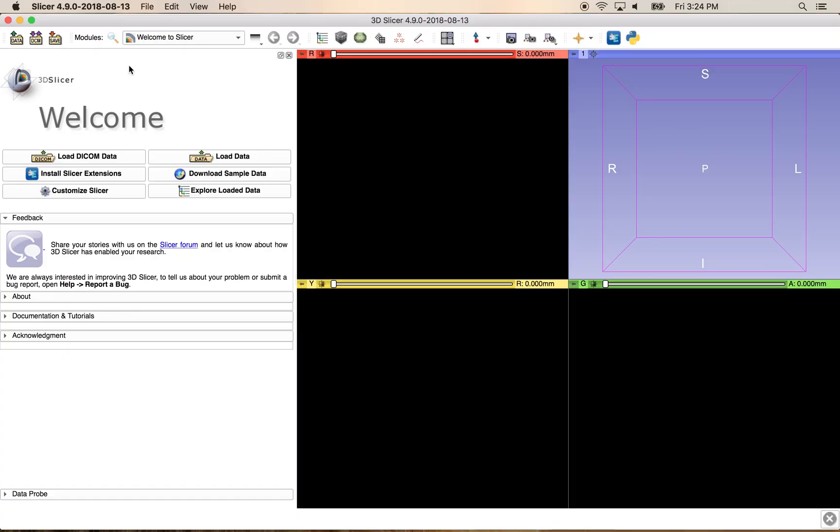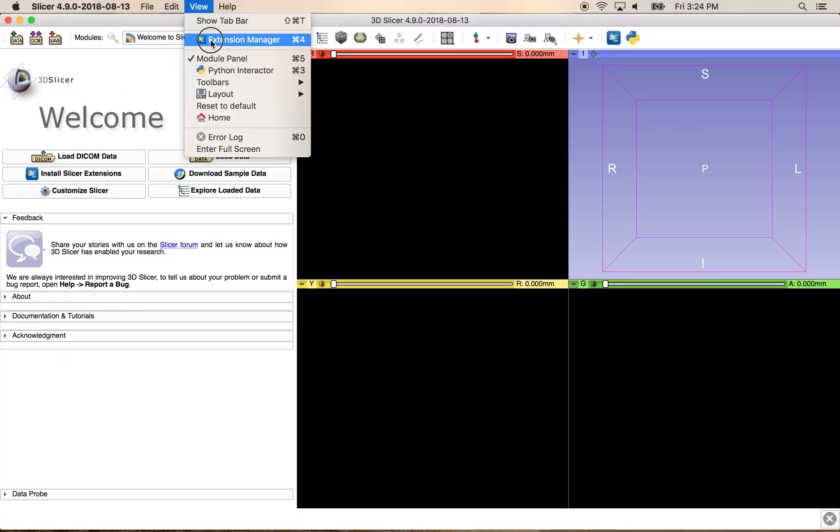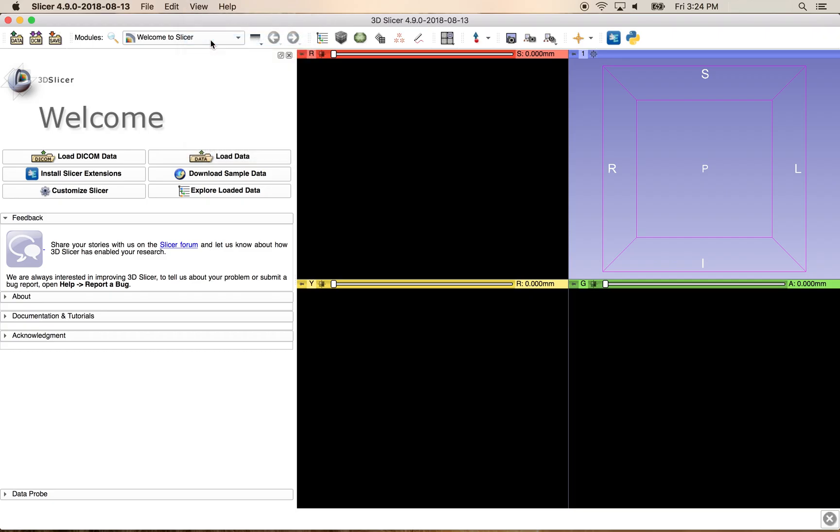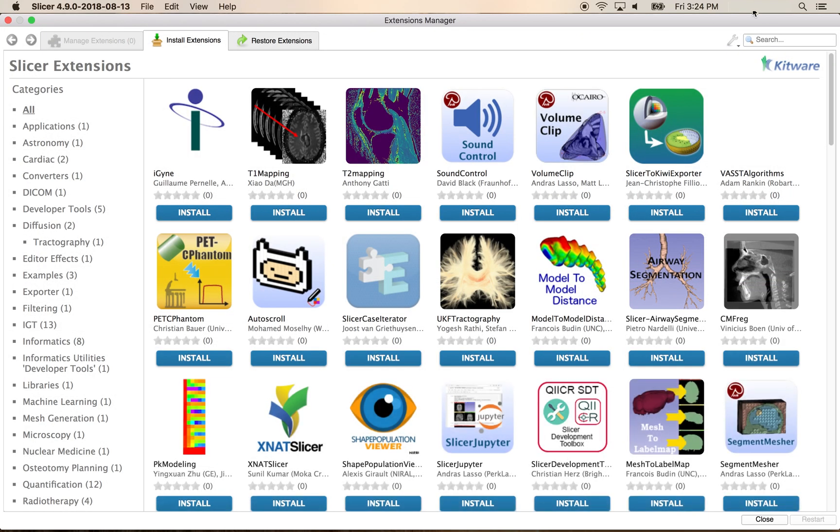From the 3D Slicer main window, navigate to the Extension Manager, then search for the suite of PET tools.